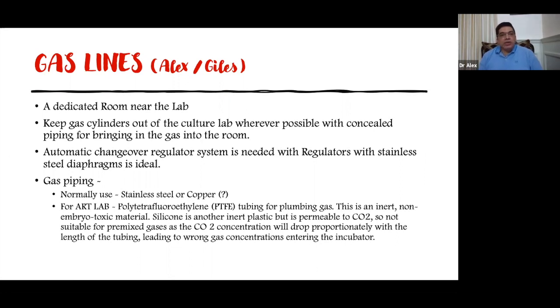Also, the gas cylinder should be kept outside in a separate room. In many places we can see the gas cylinder being kept inside the IVF lab. That should not be the way. Maybe Giles can add more points. Okay, thank you very much, Alex. Let us have Giles comment on this.